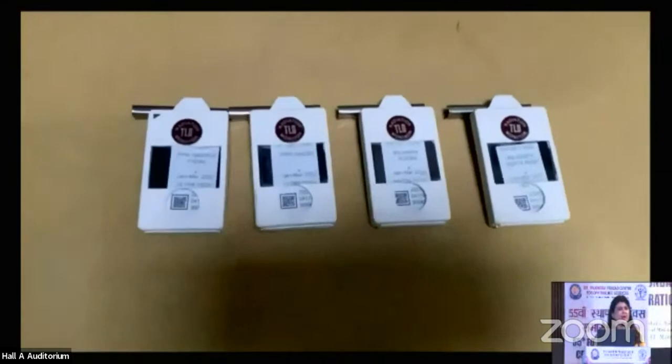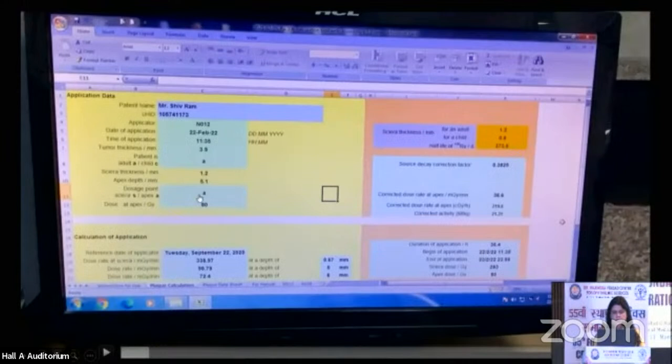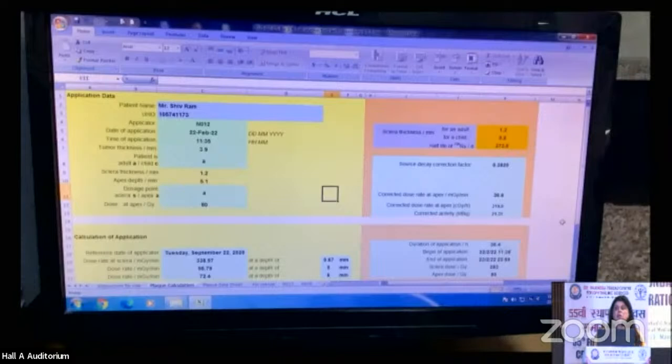Here I would like to pause a minute to show you how the dosage calculation is done. As you saw in this particular case, according to the dimensions of the tumor on ultrasonography, it had a basal diameter of a little more than 10 millimeters and an apical thickness of 3.9. According to that, our target dose to the apex of the melanoma is about 80 grays. Therefore, the dosimetry planning is done accordingly. We have with us here Dr. Subramani and Dr. Dhanabalan, who do this dosimetry planning for us. Would you like to comment or explain a little bit about this procedure?